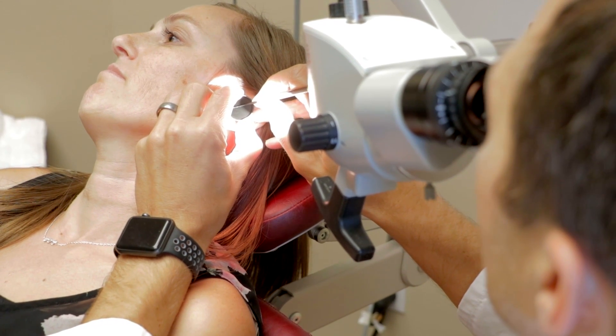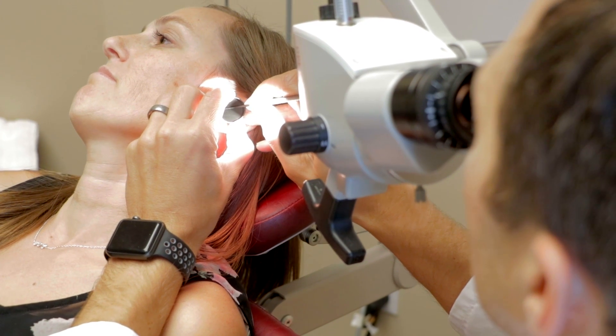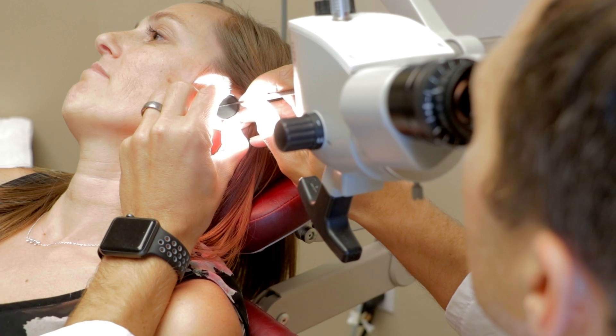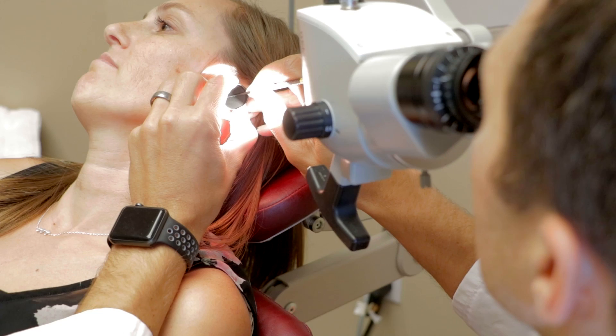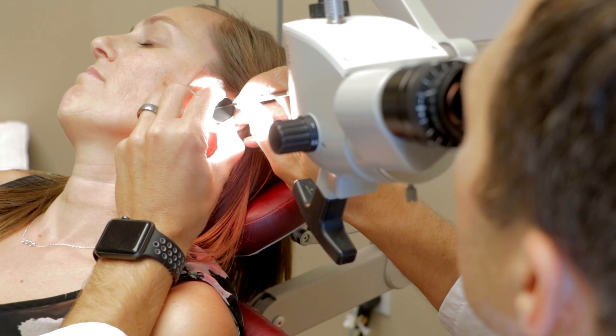Are both ends of the tube identical? Yeah. So there are ones that aren't — kind of like a little bobbin where you can kind of pull it out. In this case it's identical. It looks kind of like a spool of thread, without the thread on it. And those little flanges just prevent it from going in or out.